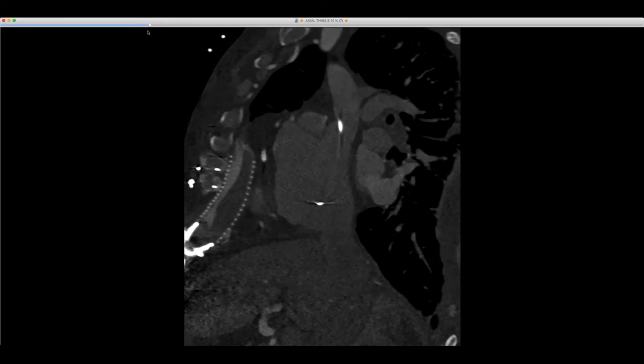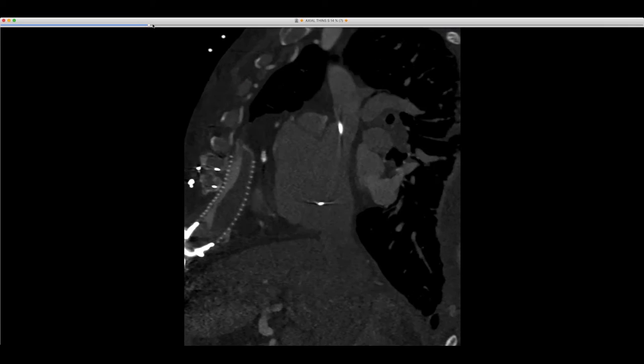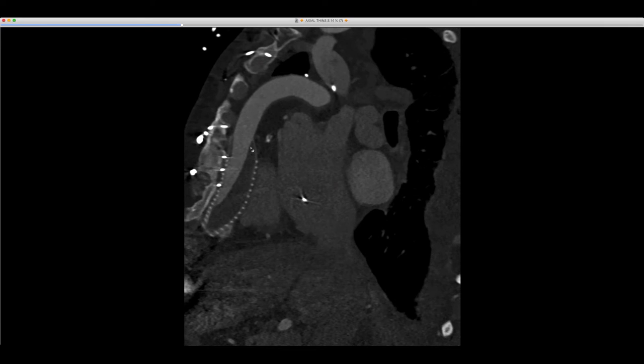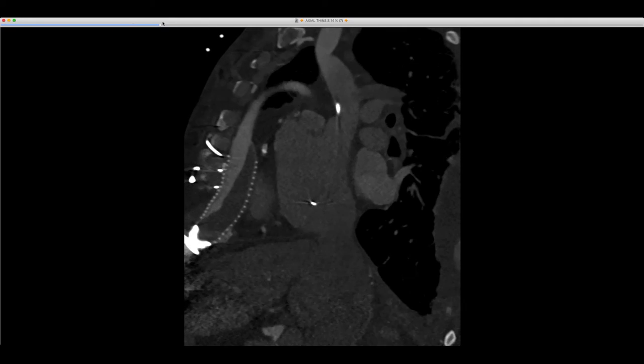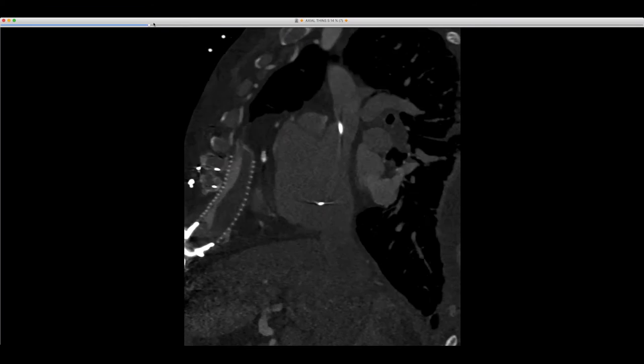When I first saw this case, I didn't know, because it looks so bad down here, especially since you can't be sure what's in the lumen and what's not. Also, it's very eccentric, so I wasn't sure how that could have happened. But the more you look at this, it starts and stops right there, which is where the wrap is. So you can't really make a good argument for this being primarily within the lumen.